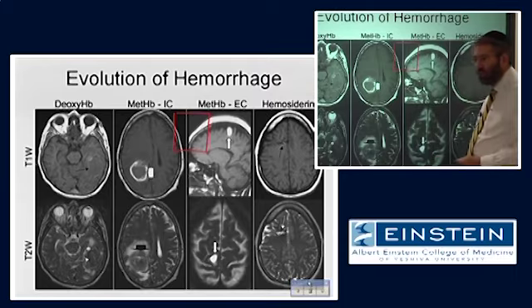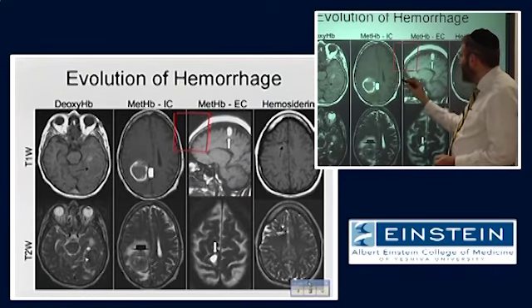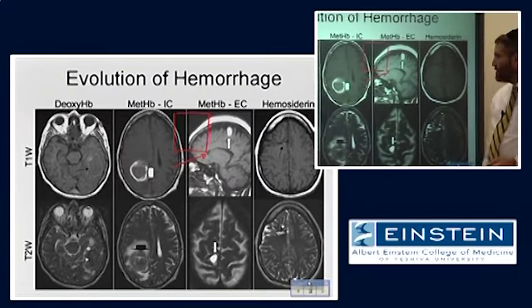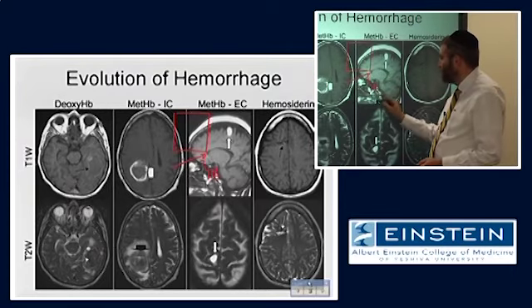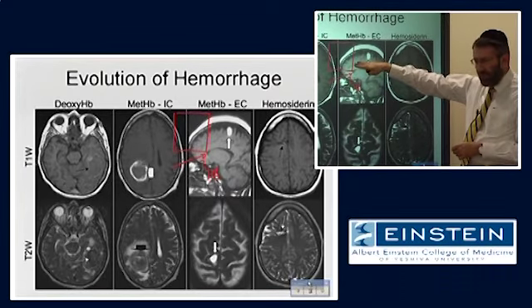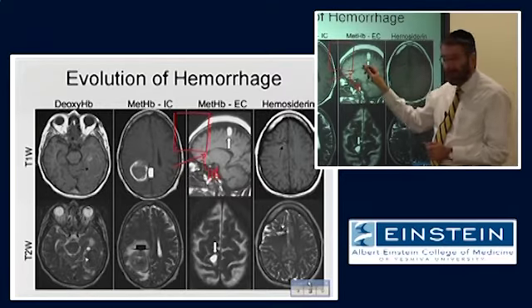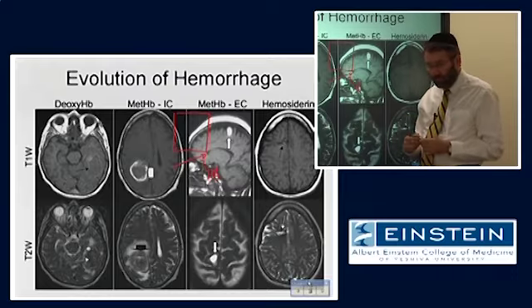we have some volume of our image where there is a gradient of magnetic field strength, which is due to the effects of hemoglobin. This isn't an applied gradient magnetic field. What I mean here is that there's variability in the magnetic field strength. We could never predict exactly what it is, but there is some point-to-point variability based on the presence of that blood.